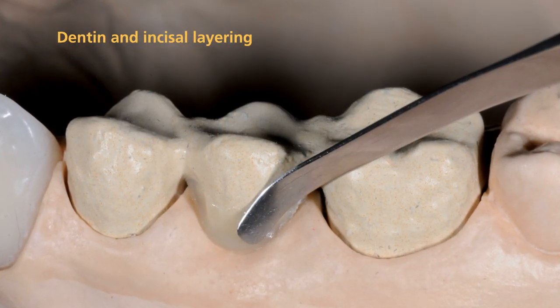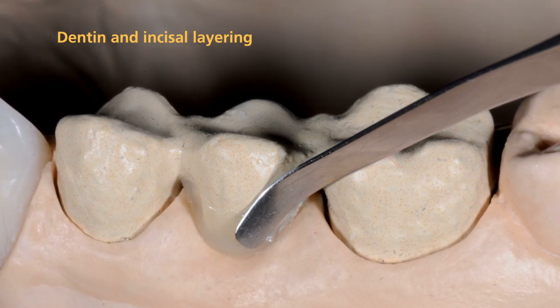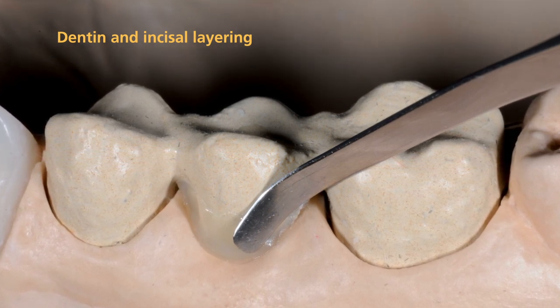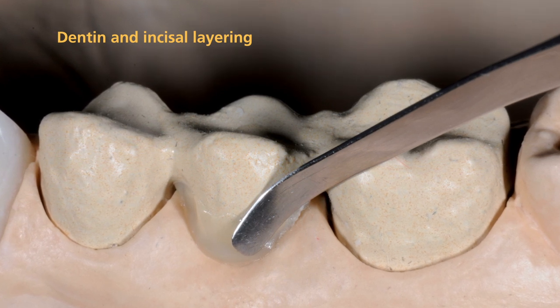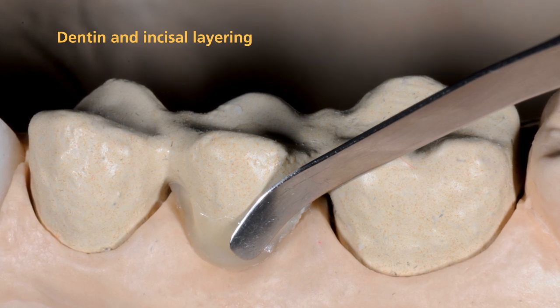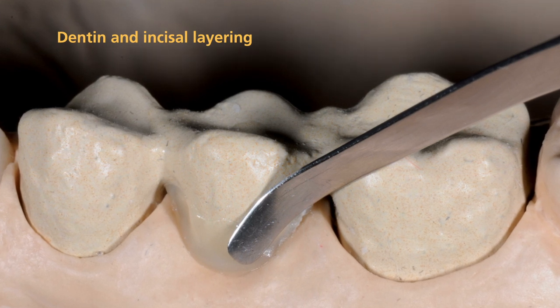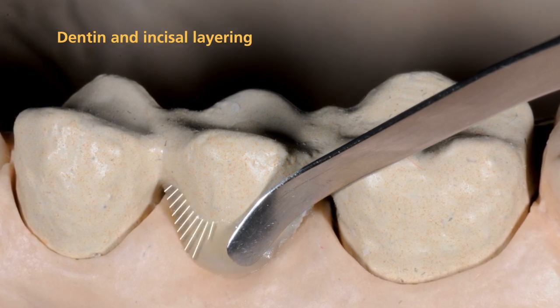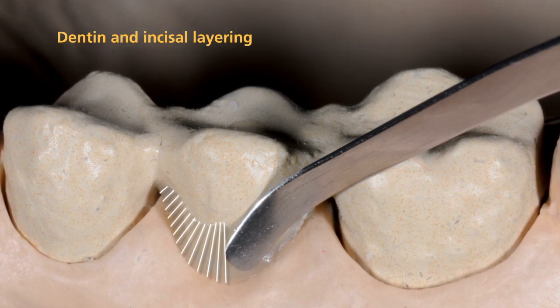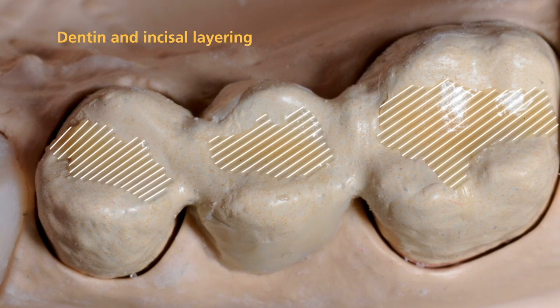Now you are ready to commence the layering procedure. The individual SR-NEXCO paste materials can be either applied according to the layering diagram or individually. Press the first layer firmly into place to achieve an effective bond between the composite and the Opaquer surface. Then build up the layers step by step. You may contour the basal surface of the pontic area with Pontic Fill. Furthermore, occlusal dentin is particularly suitable for enhancing the occlusal shade effect.